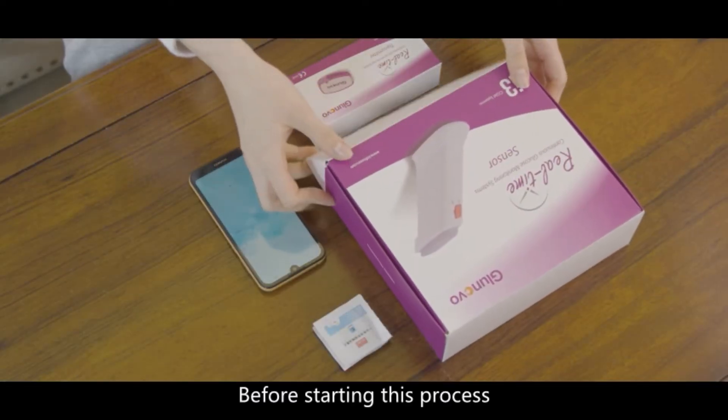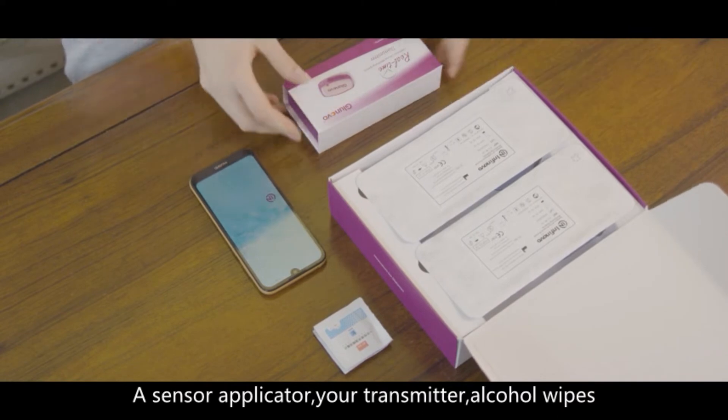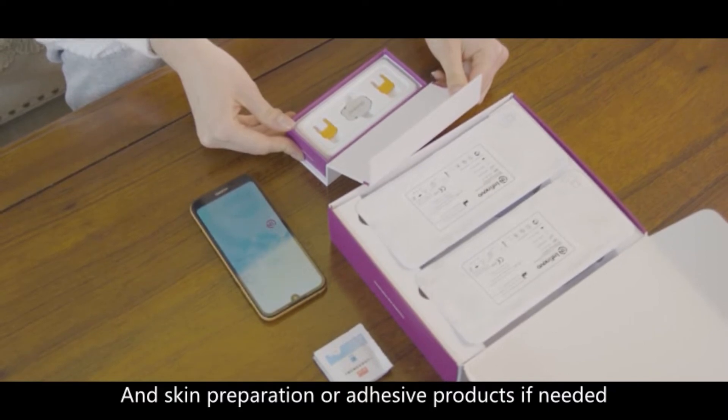Before starting this process, you should have your smartphone as a display device, a sensor applicator, your transmitter, alcohol wipes, and skin preparation or adhesive products if needed.